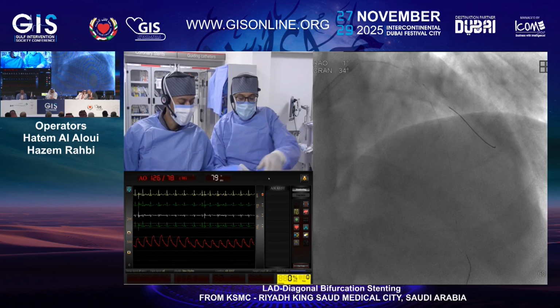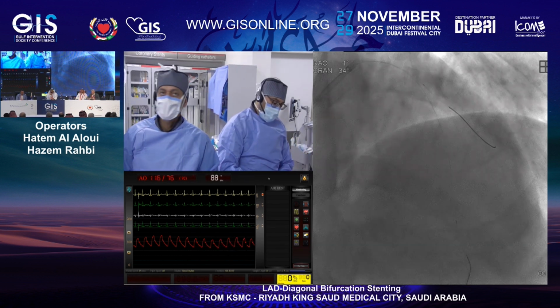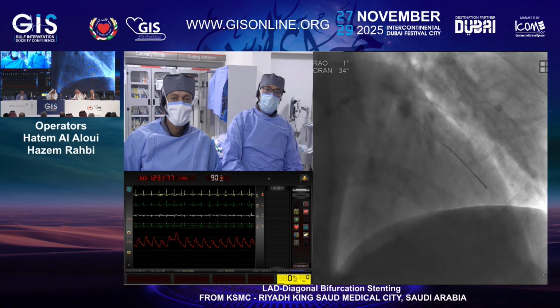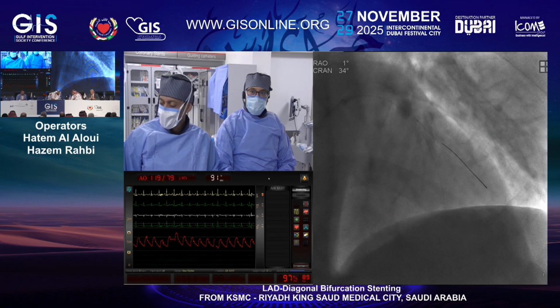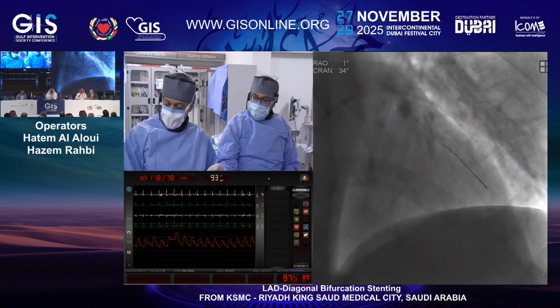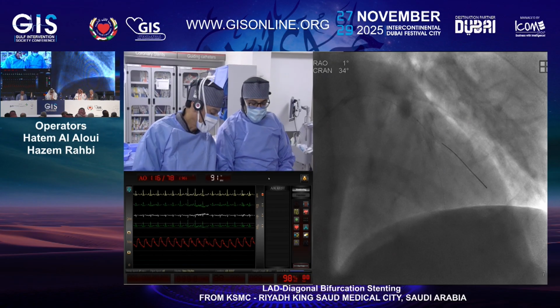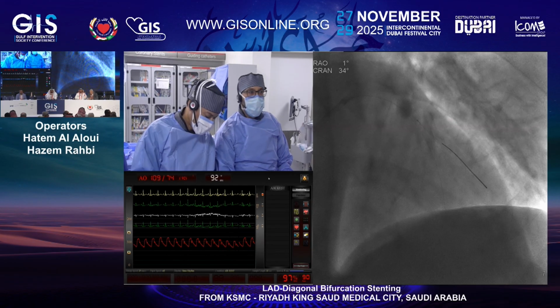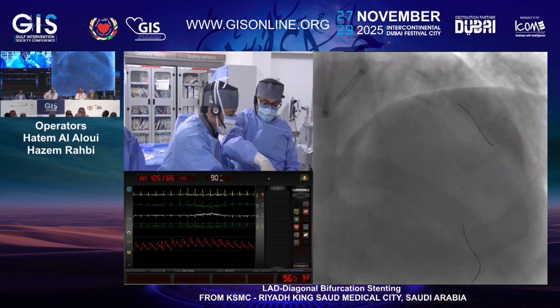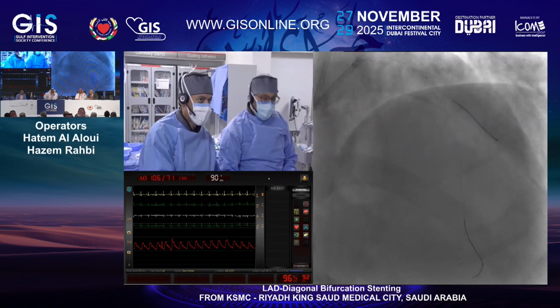So we are going to upgrade by 0.25 using a short cutting balloon, because as you have seen in the IVUS, there is some calcium there. It's a fibrocalcified plaque, so better to open it very well. The major factor for carina shifting is when you push the plaque and the vessel at the distal part, you push it on the carina.